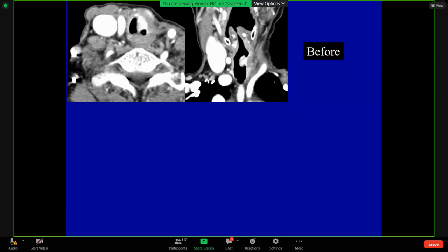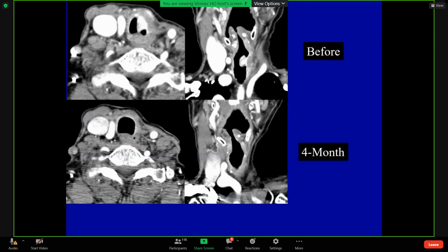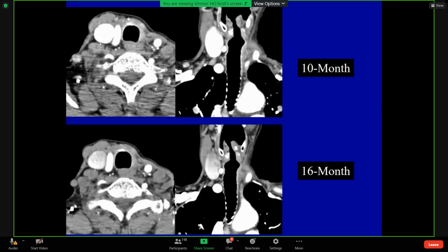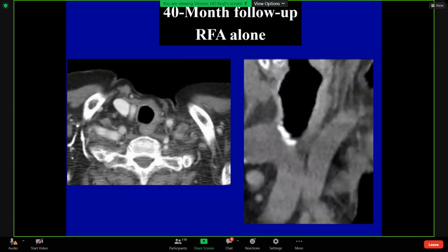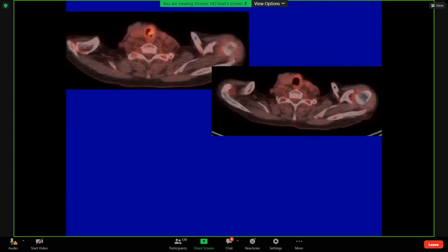Before ablation, you can see the tumor. Four months — no residual tumor. Ten months, sixteen months, forty months — still no recurrence at the treated site. What about PET-CT? Before RF ablation and after RF ablation — the lesion is resolved.